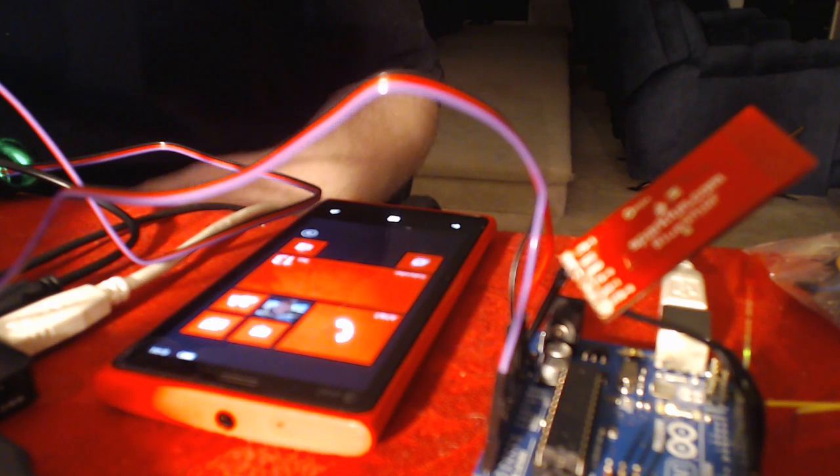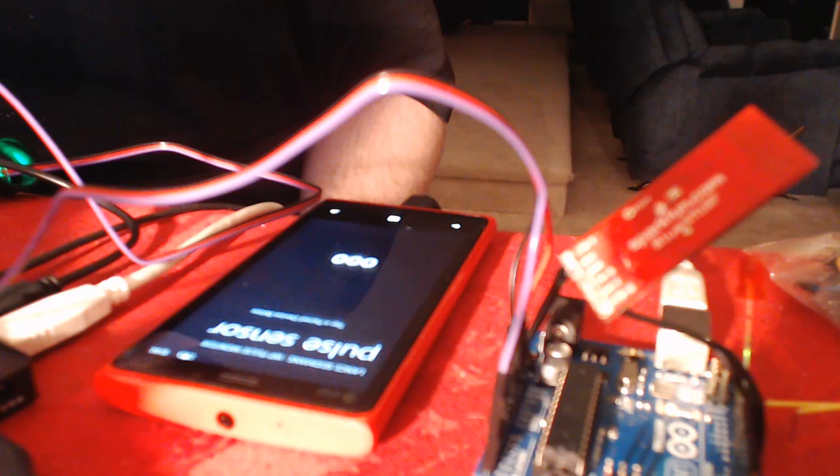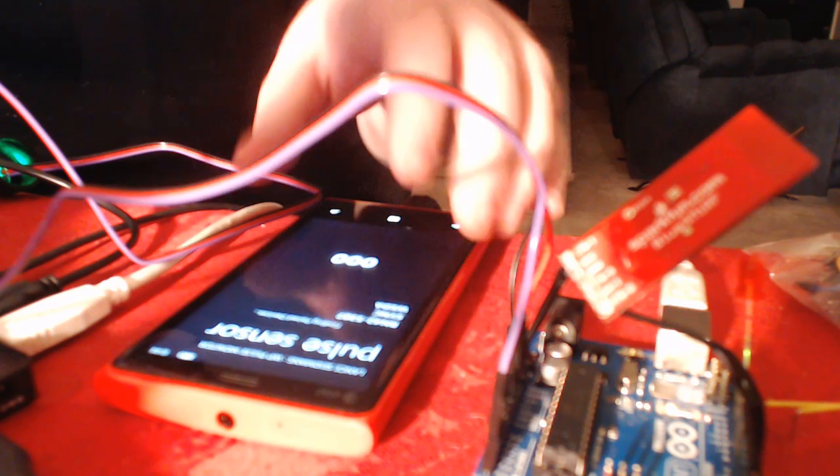Hey everybody, Lance here. So we're gonna try out my little pulse monitor that works with the Arduino. Obviously it needs a little bit of work. My dogs are excited about it. I don't know if you can hear them, but let's go ahead and do it.